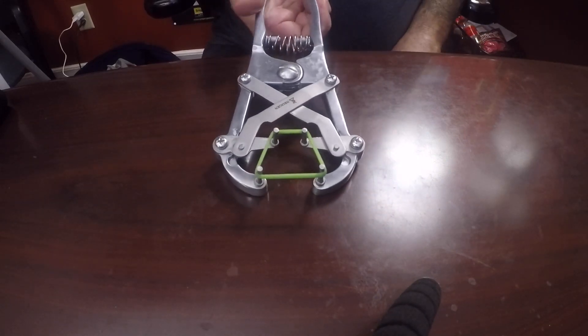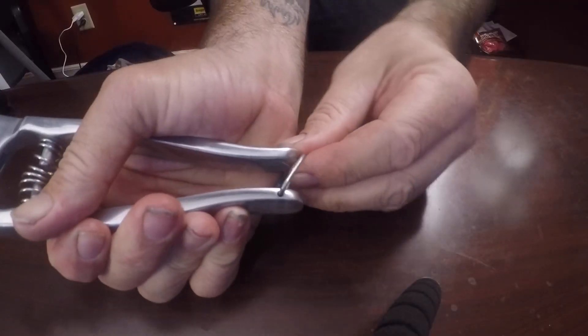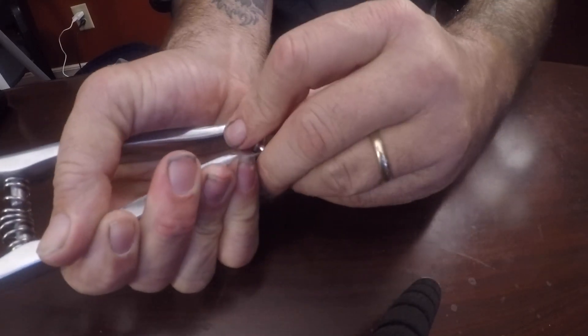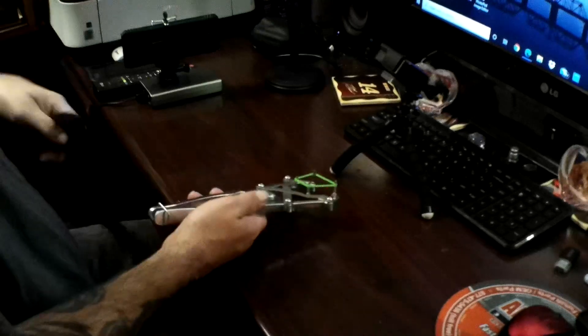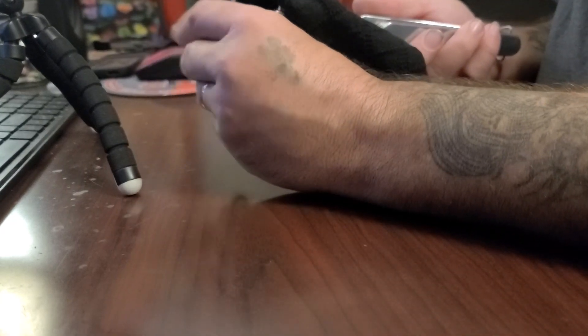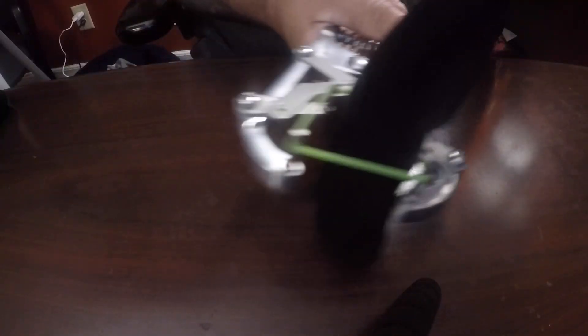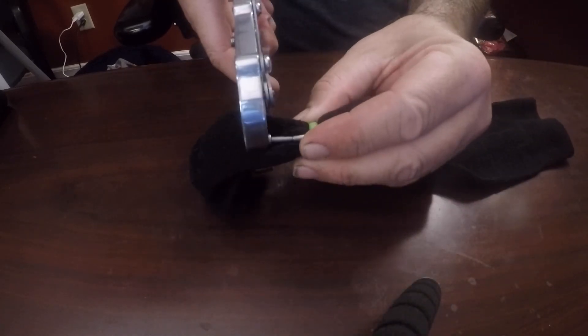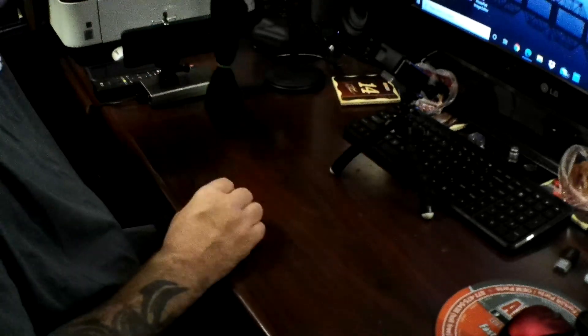Now that it's on there, go ahead and stretch it open. At the bottom there is a little clip that you can flip into place to hold it stretched open so that you can maneuver and work it around without it closing when you don't want it to. For demonstration purposes, I went ahead and filled a black sock with two marbles to simulate the sack of the bull. You're going to shove the two testicles down into the elastrator, making sure that both testicles are indeed below the band. Then release the clip at the base and close it up. As soon as it's closed up, you want to quickly roll it off and remove the elastrator. Then you quickly check to make sure that both testicles are indeed below the band.